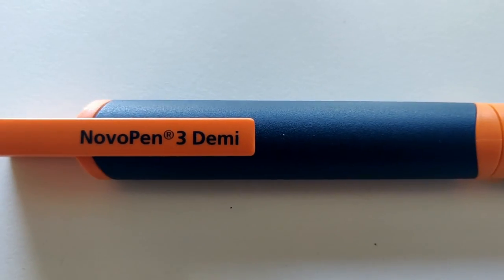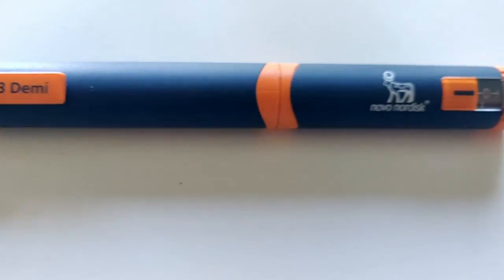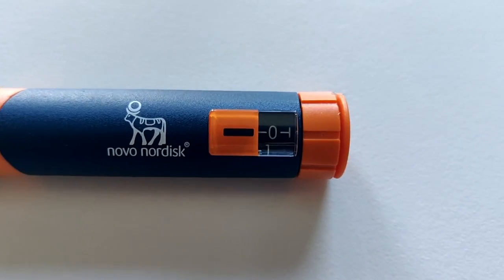Novo pen 1, 2, and 3 couldn't do half doses — they just did full doses. So this is actually my very first insulin pen as well: the Novo pen 3 Demi. The Novo pen 3 Demi came out in 1999. It doesn't have the kind of sleek design of later pens — it's almost like a matte finish, and it's orange and blue. Here's a close-up. It's made by Novo Nordisk, this is the dial, and it has no memory function — that doesn't come in until future pens.